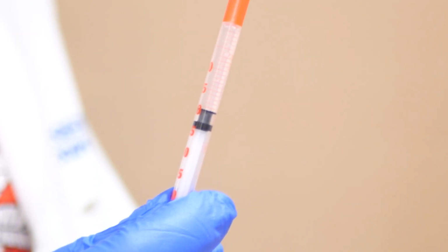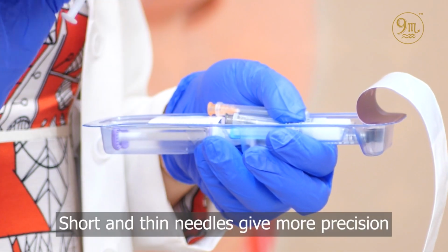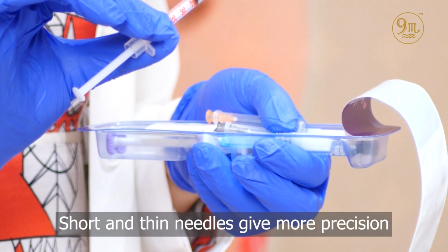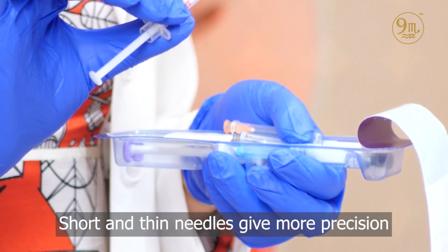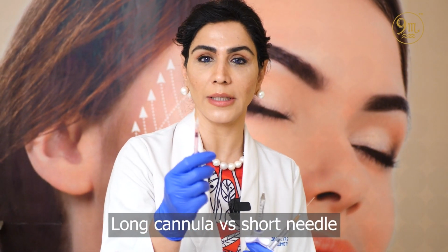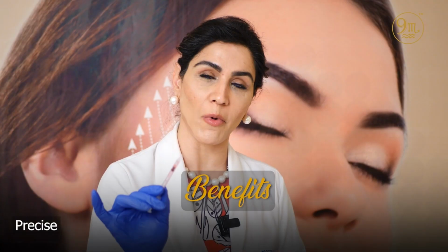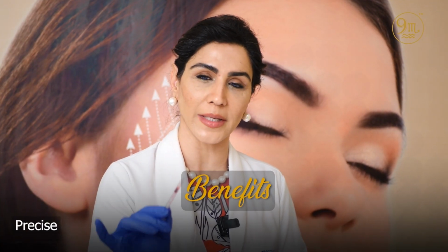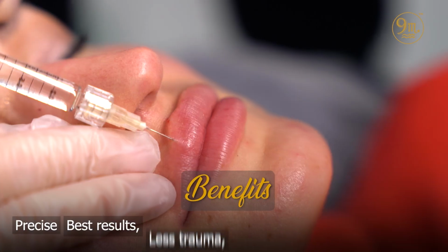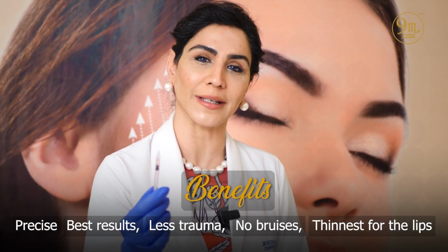So I have decanted the filler into these finer needles because I want to be more precise and more to the point on a small structure like the lip. This one, or the long cannula, or a short needle for the lip, which is my preference, of course the shortest one, to be more precise and to be more to the point, to give the best result with less trauma, no chances of bruising. Thinnest and the shortest possible needle for the lips.